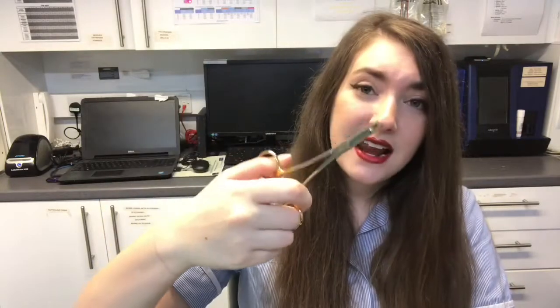We also have some needle holders here, and this allows the vet to suture the needle through any muscles or skin of the patient and to close back up after the surgery.